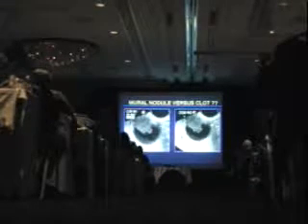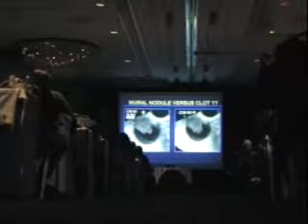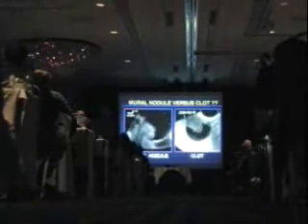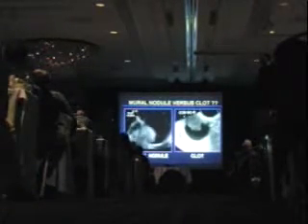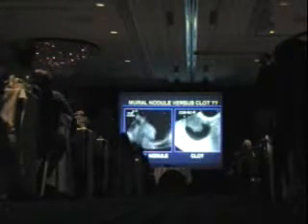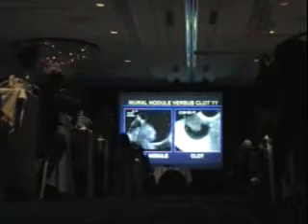The next thing I would do is what we are doing here. I know it looks funny, but I love to probe with the probe, and you can see it's very passive. It's like jello or jelly. It jiggles, and a tumor, which we see here, doesn't jiggle, right? That's a solid mass in there, and that's not jiggling, whereas that is. So I certainly would follow this, but I'd be much more inclined to think that that is a blood clot.